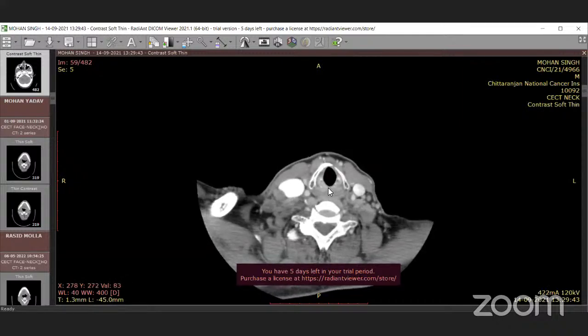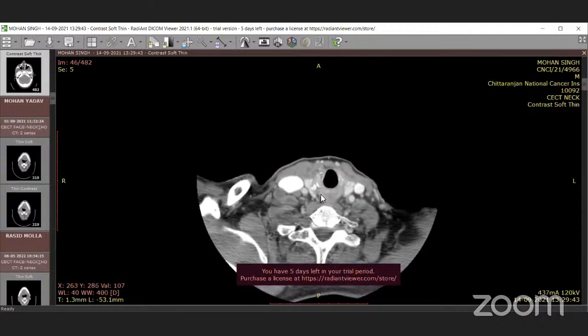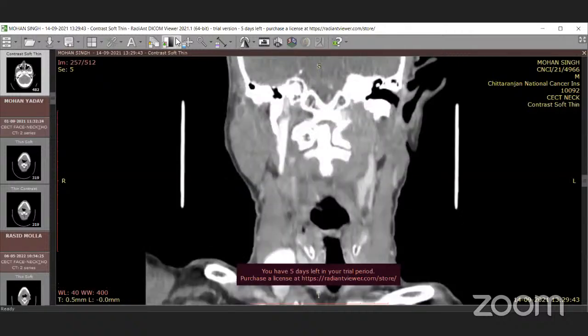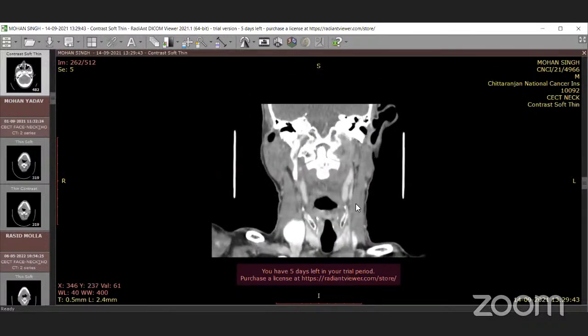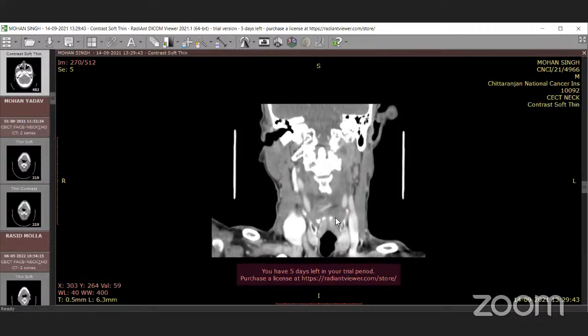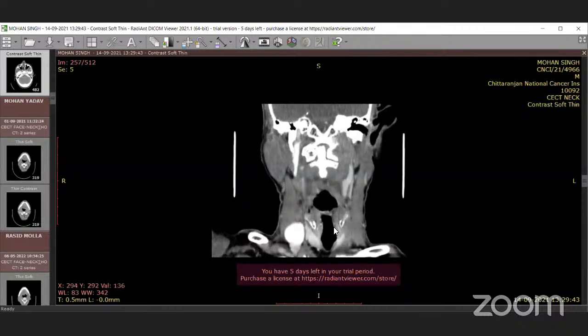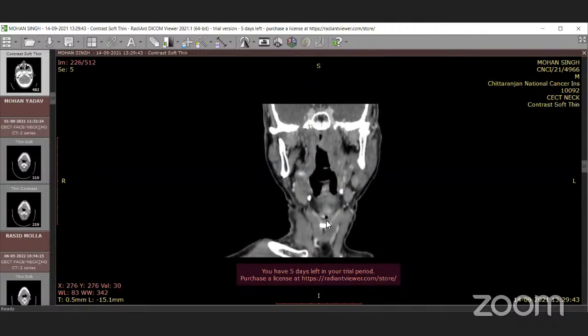As we go further down, the division of glottis to subglottis radiologically is defined on the coronal plane. So just let me zoom it out a bit. And this is the level of the arytenoid cartilages. And as we come forward, this structure is the muscle, and as we can make out, this fuses here the level of the anterior commissure. Okay, this is the anterior commissure.